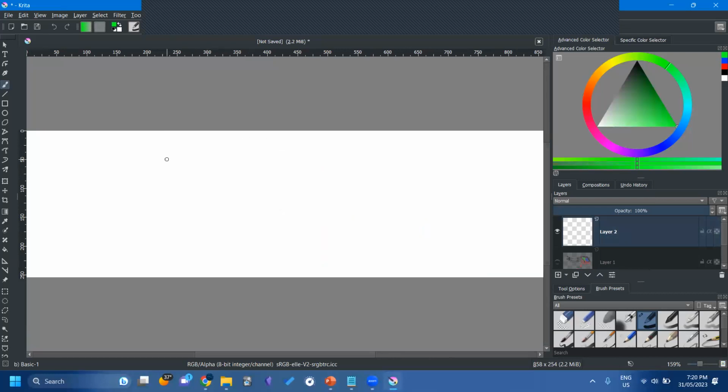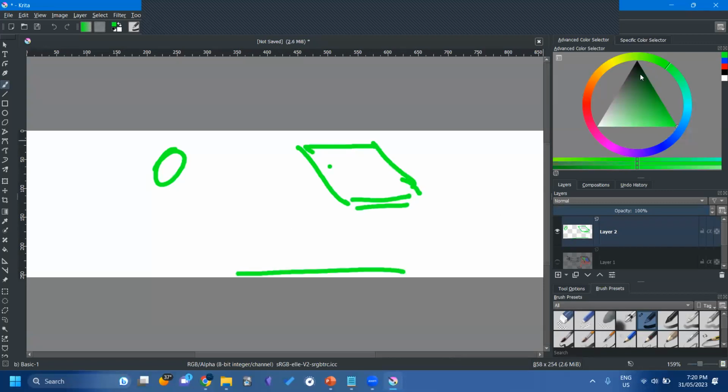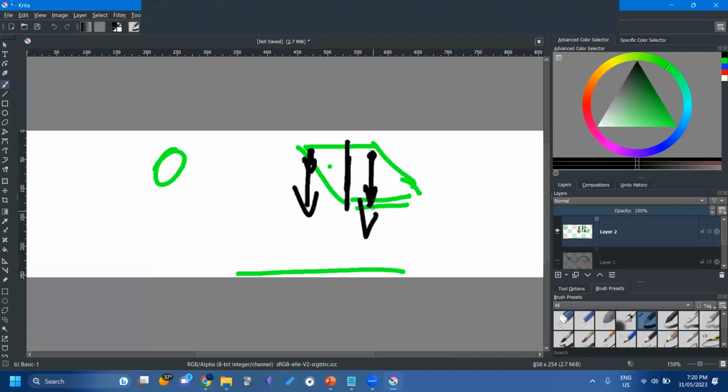All right. So cathode, anode. It's at an angle. That's okay, it can be green. And then you have your detector. Now the ones over here are going to have a lot less material to pass through, like we said. What that means is they're going to be very high energy when they leave, right? Whereas the ones over here have a lot more material to pass through, so they'll lose a lot of energy. And so the ones leaving this area are going to be very low energy, whereas the ones leaving this area are going to be very high energy.